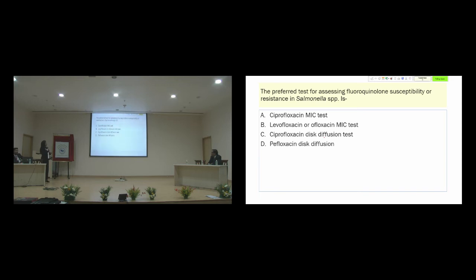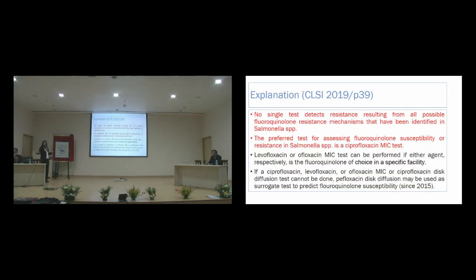The preferred test for assessing fluoroquinolone susceptibility or resistance in Salmonella species. Which of these is the preferred test? The answer is the ciprofloxacin MIC test. If there is one test which you can rely on, that is the ciprofloxacin MIC test.